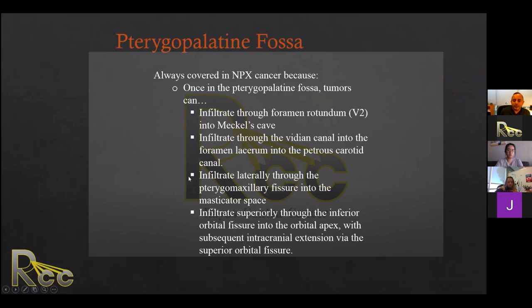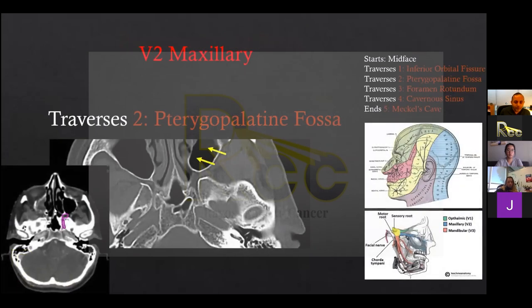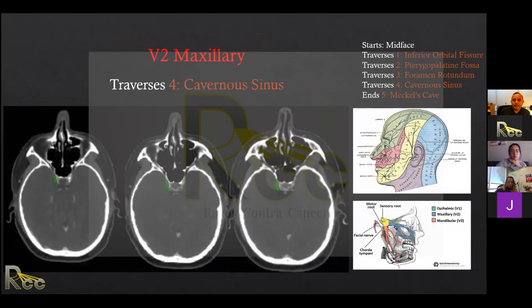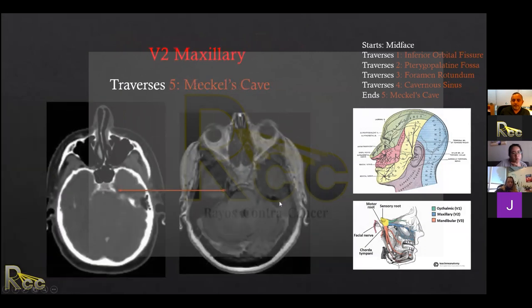Again, I won't dwell a lot on this, but in nasopharynx patients, you are always, always going to cover this area because you know that nasopharynx cancers oftentimes will spread intracranially through these paths. So once they similarly come into the cavernous sinus, as I showed you, these are just showing you some volumes of the cavernous sinus, and they can end up in Meckel's cave right here. So here again, showing you Meckel's cave, showing you that trigeminal nerve, here's the pons in this patient.